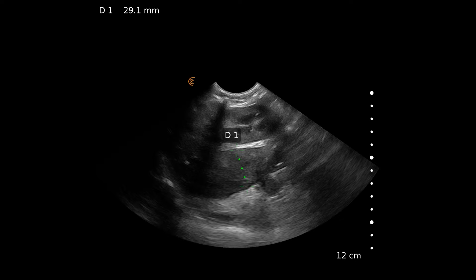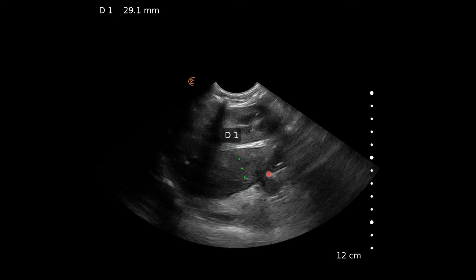Here is the measurement of the left adrenal, measuring across the caudal pole. We have the left kidney above, which shows relatively how large this left adrenal is. Normally in a small dog this size, I'd expect the left adrenal to be about half a centimetre or so, but this left adrenal was measuring at nearly three centimetres across — so very, very large.